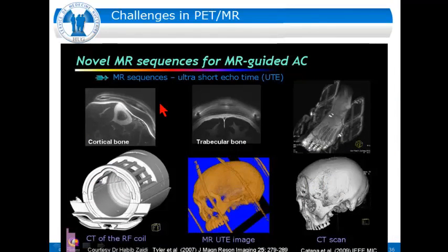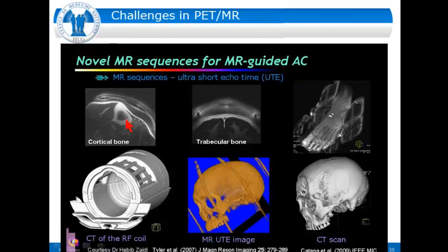Imaging bone is still very difficult in MR-guided attenuation correction, but new UTE sequences are being developed for this purpose. When looking at these images, they give really nice images of trabecular and cortical bone, and I think we are also on a good path there.